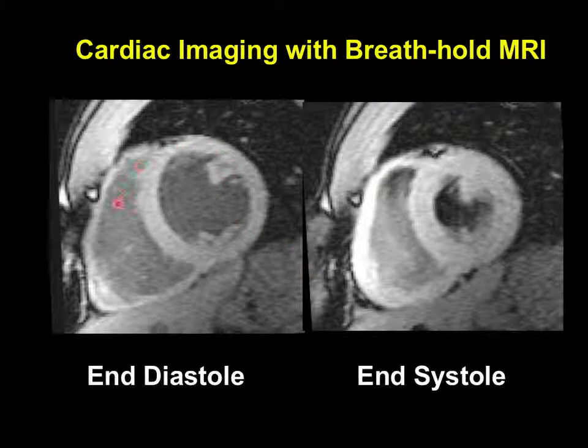So with MR slices, we have this. It's usually about 5 to 7 millimeters thick slice, and the in-plane resolution on these is usually about 1.5 millimeters by 1.5 millimeters. That's the voxel size. In an MR, that's a reasonable way to state resolution, okay, is the voxel size, because usually you match your voxel size to the resolution pretty well.